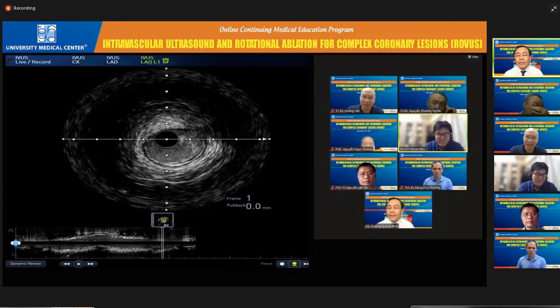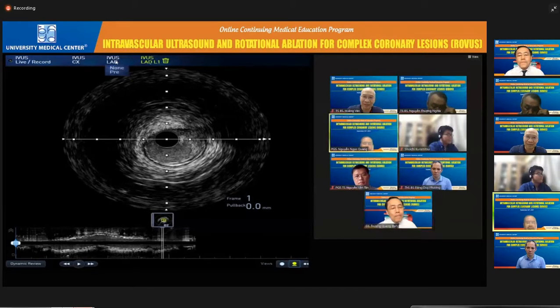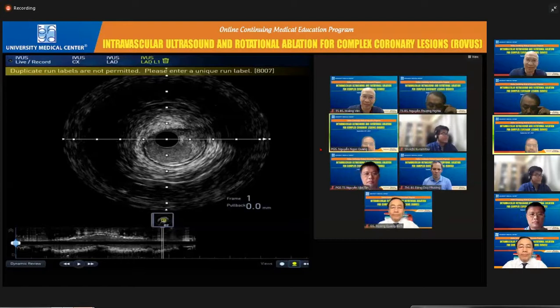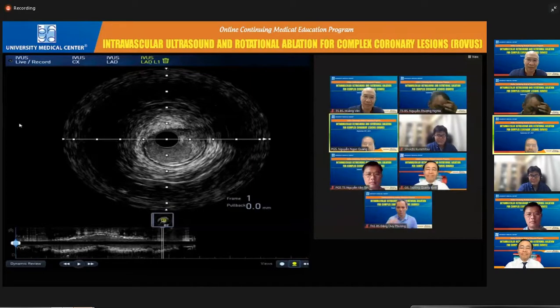Thank you, Dr. Kuramitsu. How about Professor Nguyễn Ngọc Quang? Do you think that in this case, maybe IVUS may be better than FFR for the indication for the PCI for the left main? Thank you, Professor Bing, for the very challenging question. I'm sure that we need some method to evaluate the ischemia. However, to do the FFR in the left main is not easy, and sometimes there is some bias when you measure the FFR.